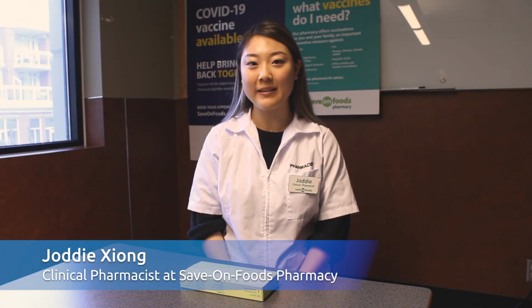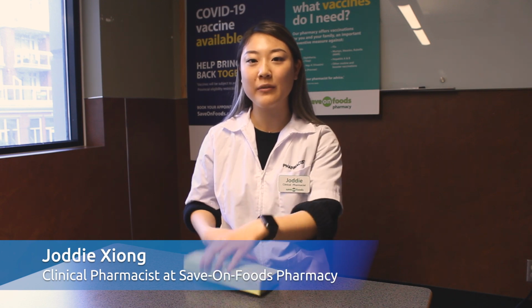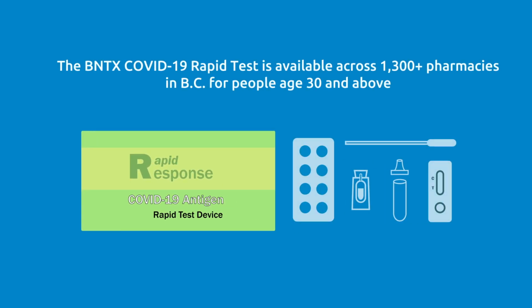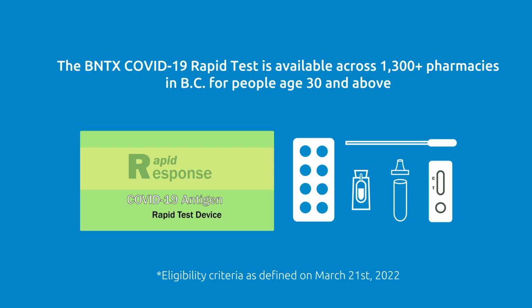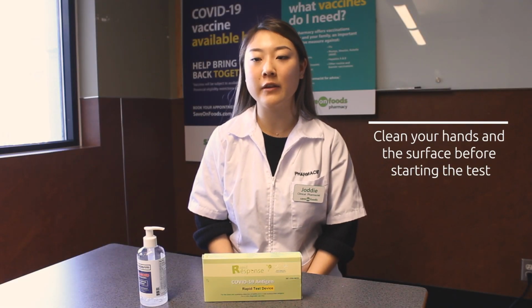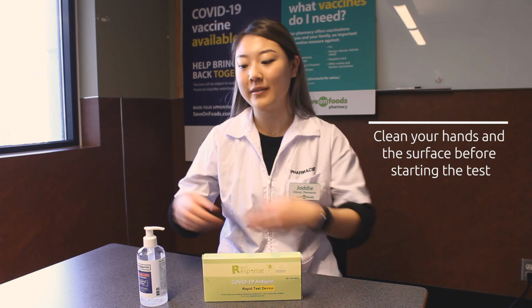I'm a clinical pharmacist at Save On Foods Pharmacy. Today, we'll be demonstrating the rapid response, rapid antigen test. Before starting the test, make sure you clean the surface and clean your hands.